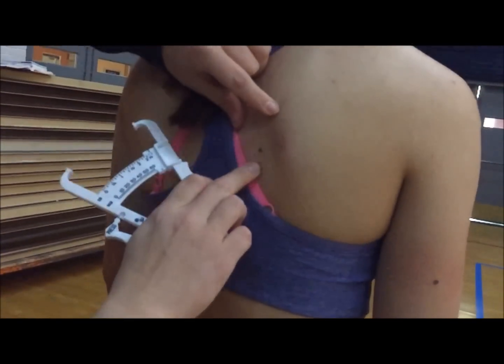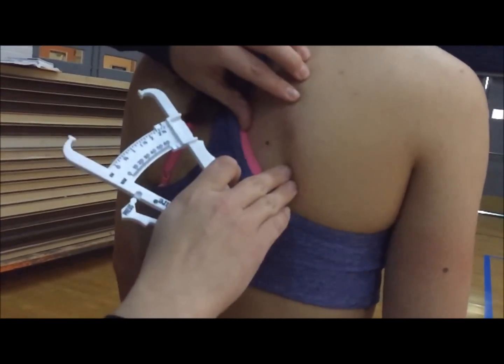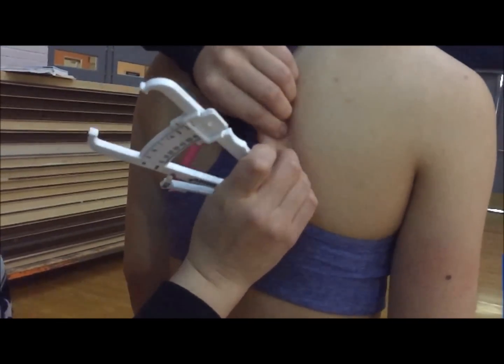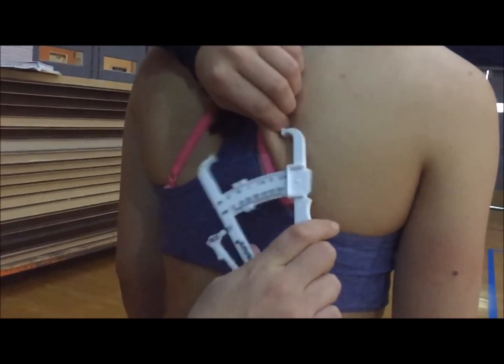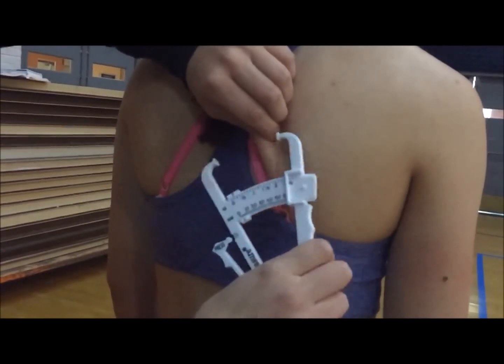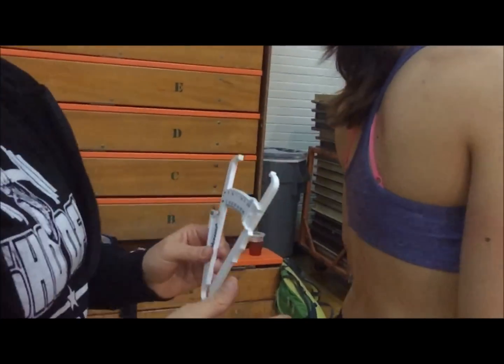For the subscapular, make sure that you are at a diagonal fold and that you separate the skin from the muscle. Make sure to maintain your pinch and that the caliper is directly on the skin. Reset.